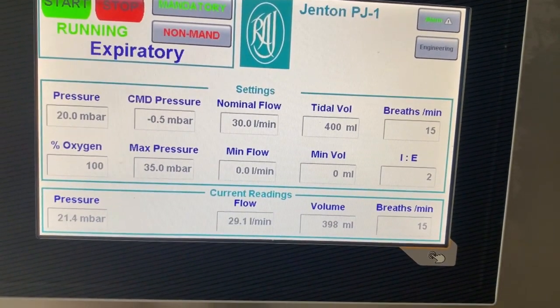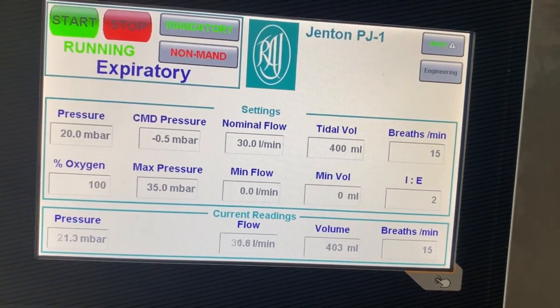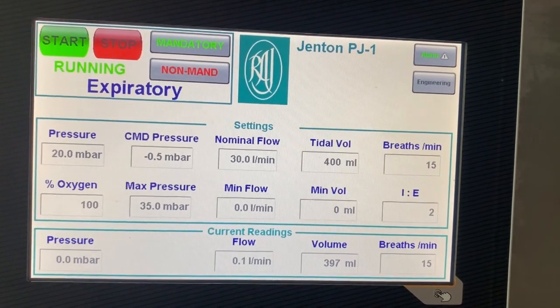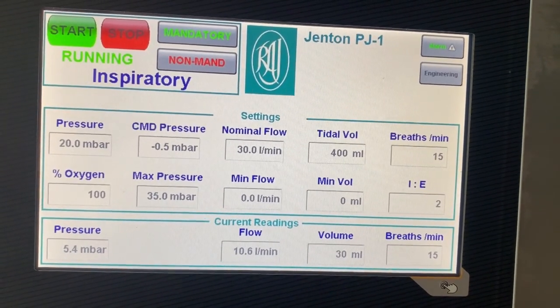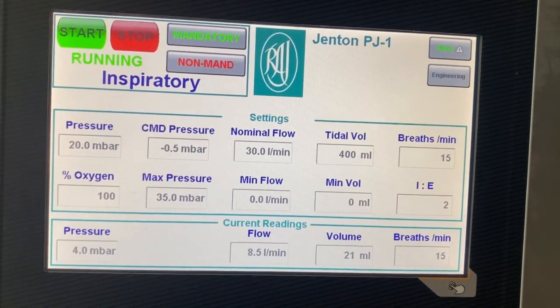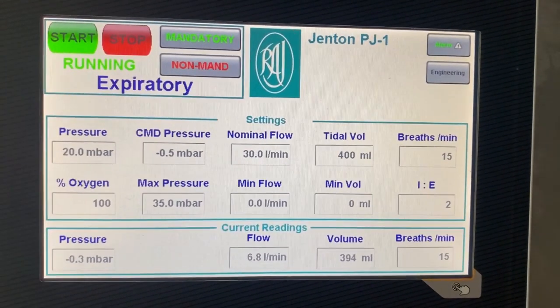Both mandatory and non-mandatory ventilation is available. In the case of non-mandatory, the user can set the command pressure and, of course, if the breaths per minute drop below a preset level, the unit will alarm and automatically switch to mandatory mode. In mandatory mode, the required breaths per minute can be set as well.